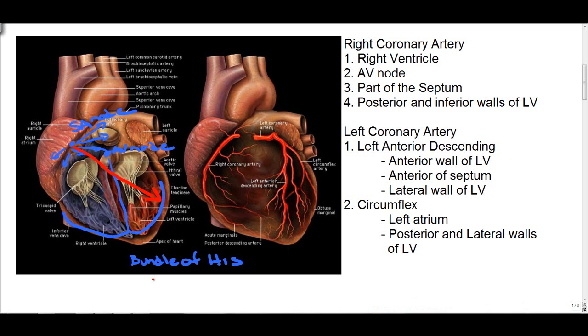Now that's the basic depolarization. Make sure to read up about this in your EKG books to get further details, but that's the basic idea behind all this. Next, we will talk about coronary circulation.